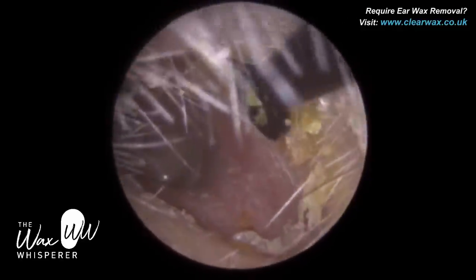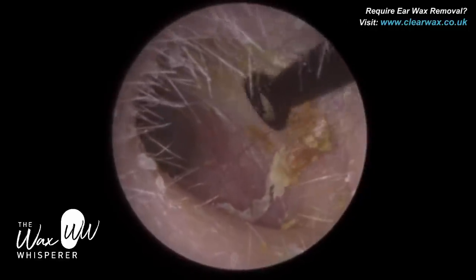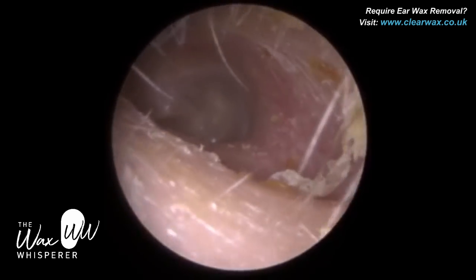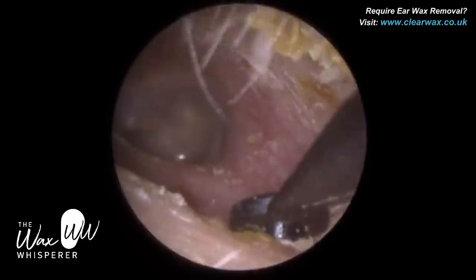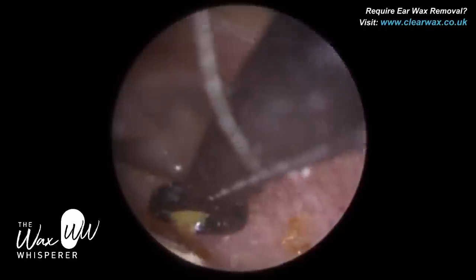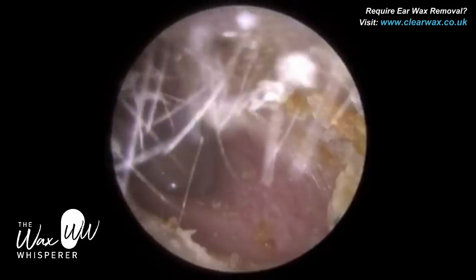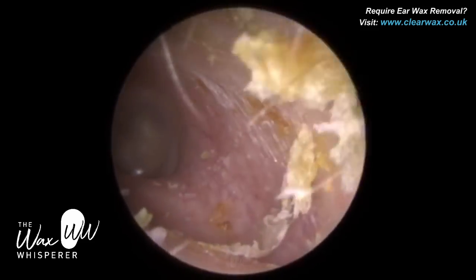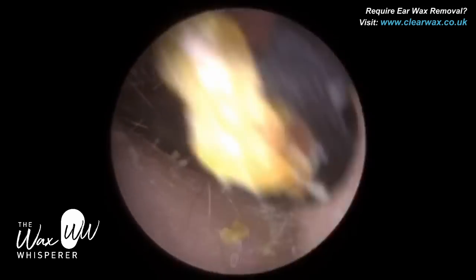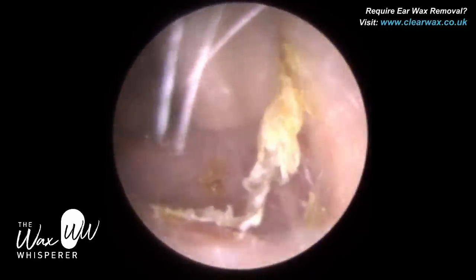With an endoscope, you're not using binocular vision in the traditional sense, because both eyes are not looking inside the ear canal — instead, you're viewing a monitor. However, you can get depth perception using monocular cues. You're looking with both eyes at a screen, but technically that's just one viewpoint. You achieve depth through shadows in the ear canal, landmarks in the ear canal, or simply by inserting the endoscope further into the ear — the further in you go, the better you can judge the distance.